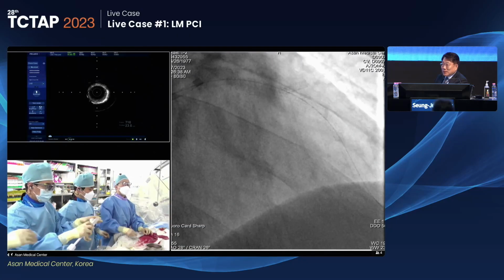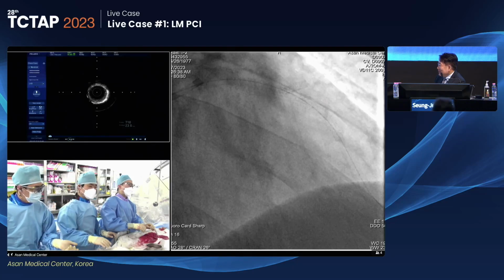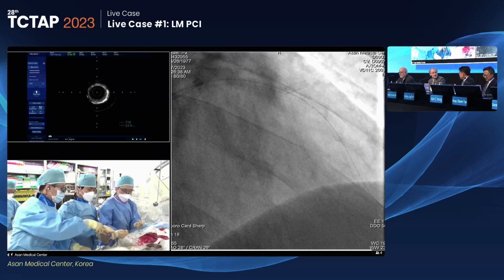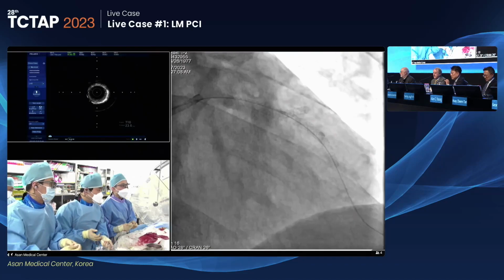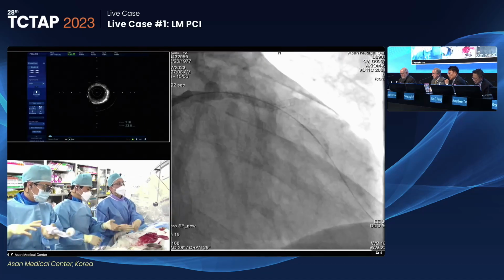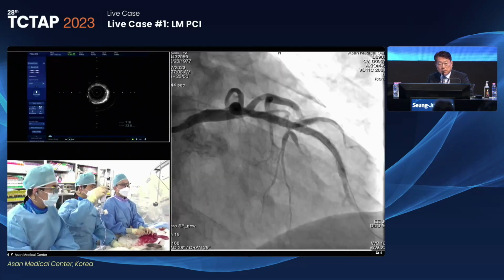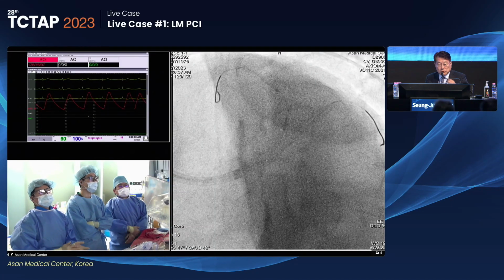I followed Dr. Antonio during the last almost... He changed a lot. But I agree with you that we need the data, but it takes time. You know, Andrew? It's not easy to do a prospective randomized study of DCB versus stenting. I think it's great, Dr. Kang. So you want to do the high pressure inflation and IVUS, right? Yes. All right, we want to move to Dr. An's case. Yes. Dr. An. All right.